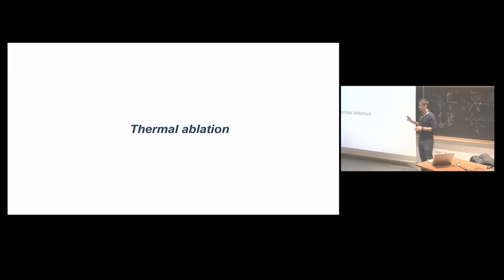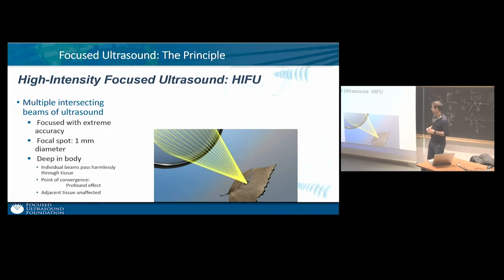So I'm going to start with thermal ablation. How can we get this high intensity focused ultrasound? Maybe you will find this term HIFU in the literature. We can do that by making a very strong focusing of our ultrasound beam. And how do we do that?